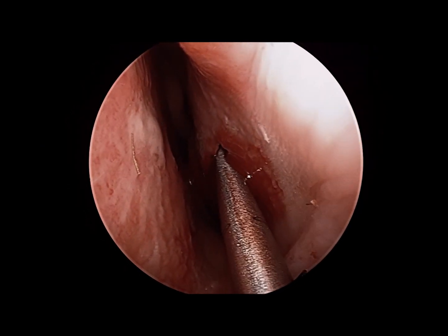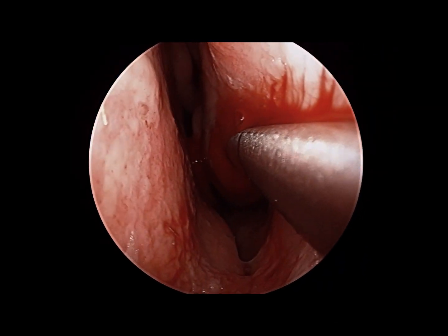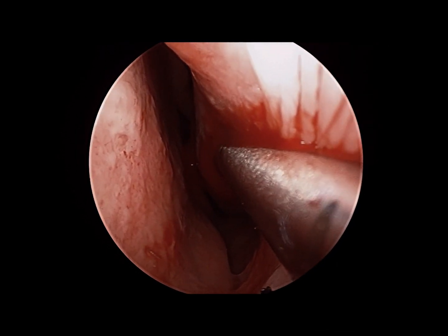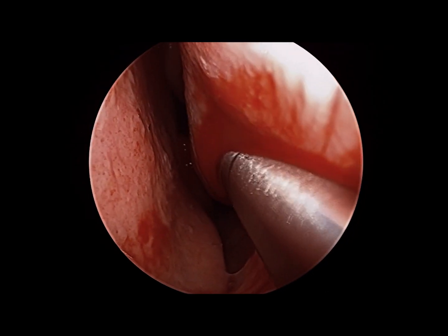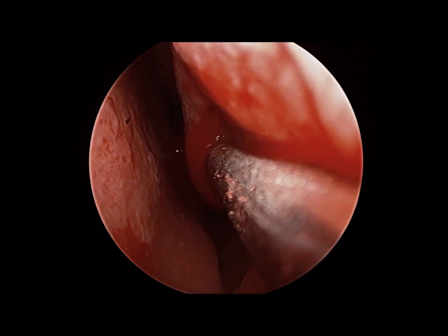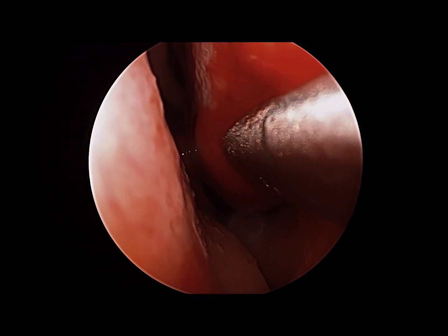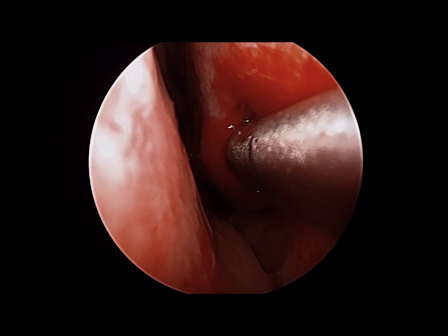Of note — not described in anatomy books — patients seem to have a somewhat invisible fascial layer. I believe it is at the vertical level of the patient's nasolacrimal duct, and one needs to actually pass through that layer to be in a safer submucosal plane posteriorly. That area is somewhat firm and could inadvertently cause you to pass your instrument too medially, popping out of the mucosa, so you have to be careful.